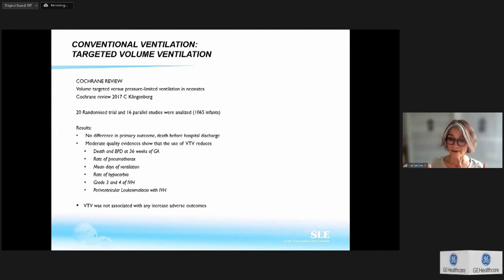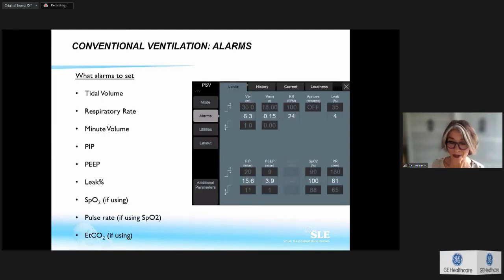But keep in mind that you are the one who has to set it. If you don't set a proper TI, if you don't set, for example, a proper tidal volume, you won't have any benefit. So you also have to set the proper tidal volume for those patients.